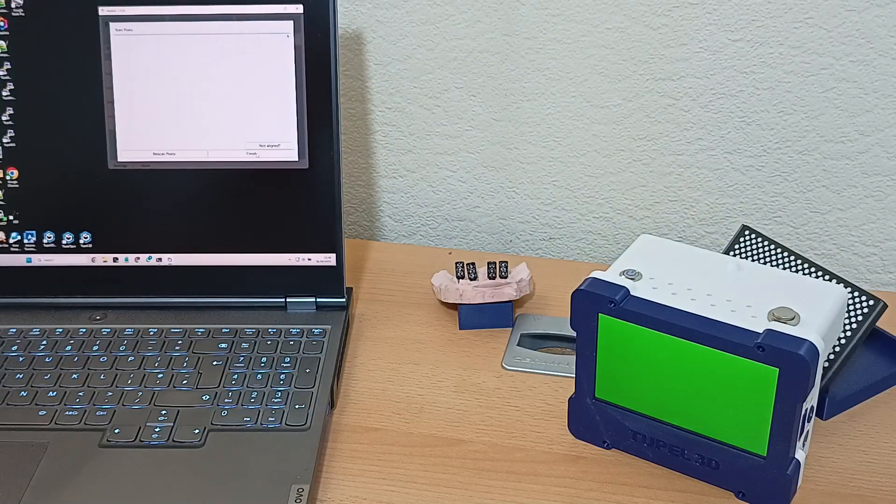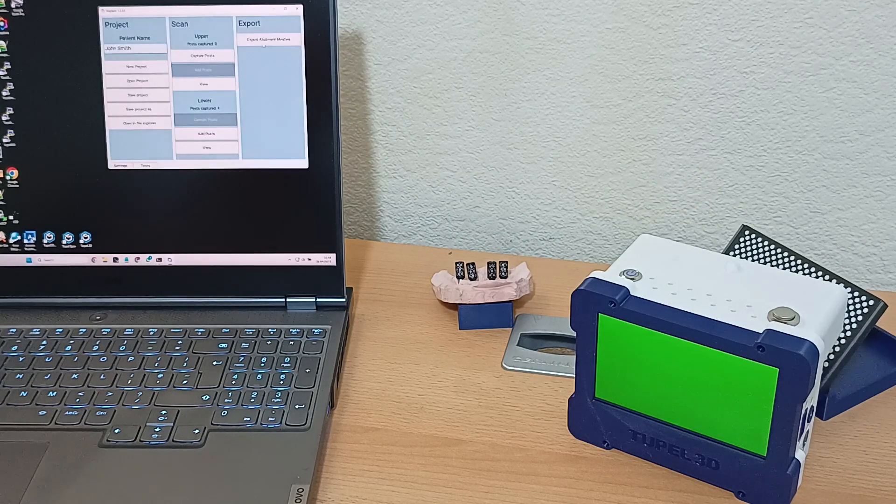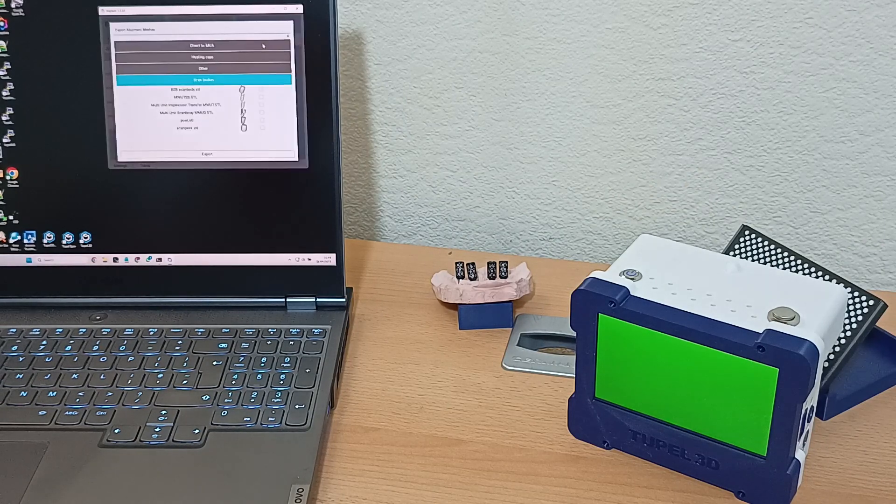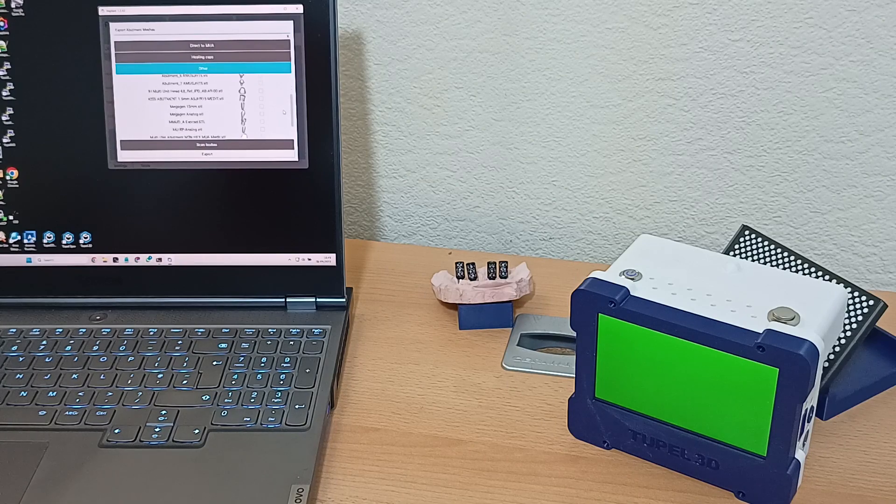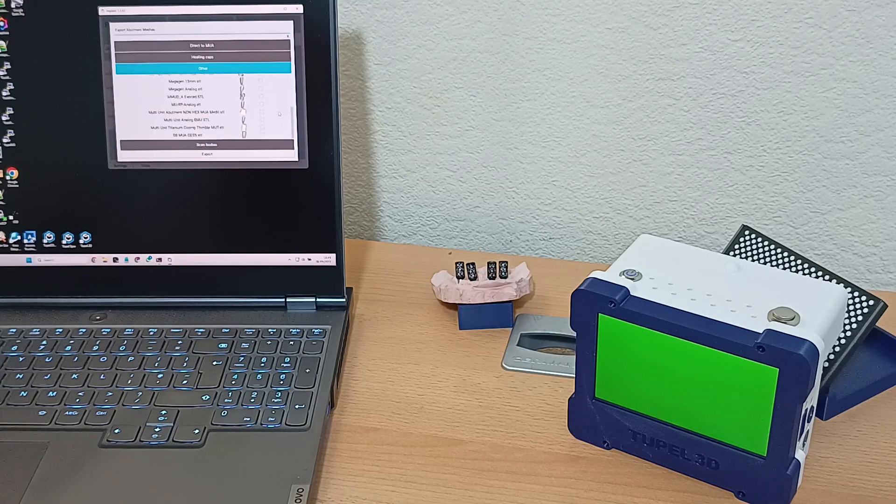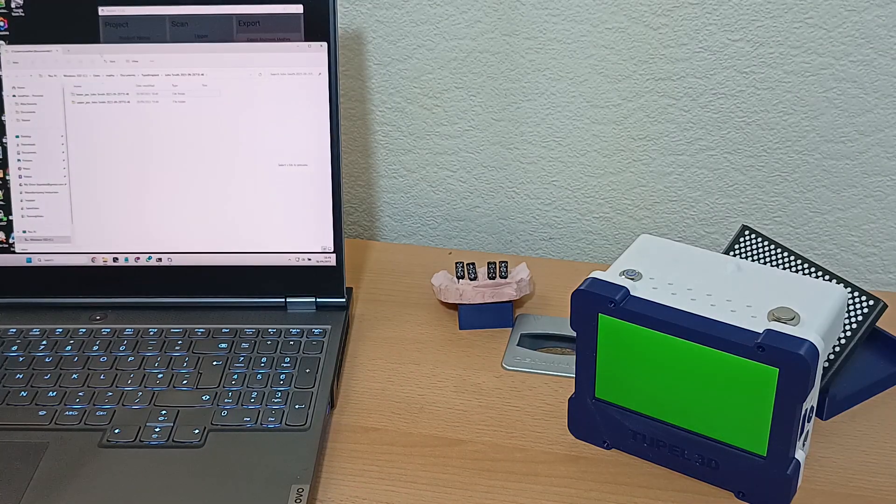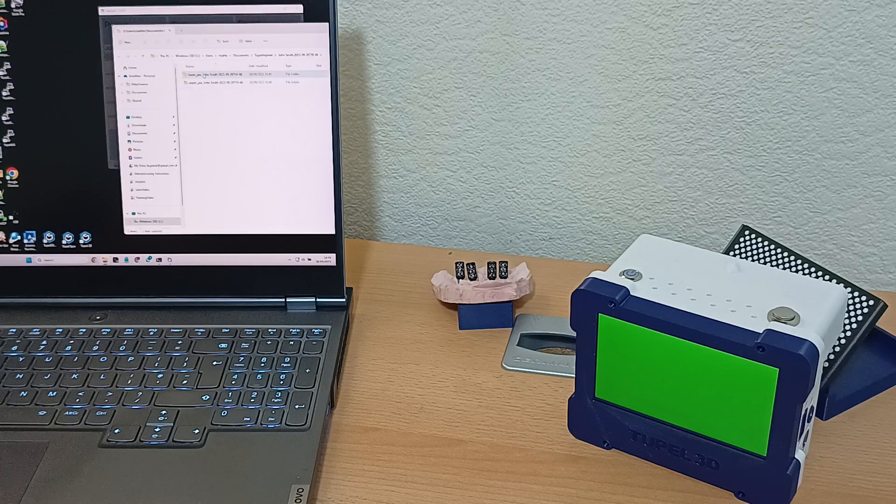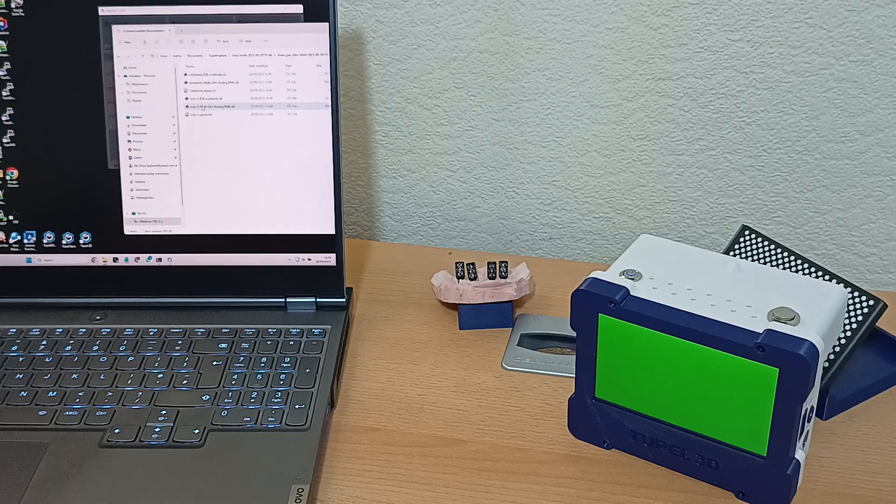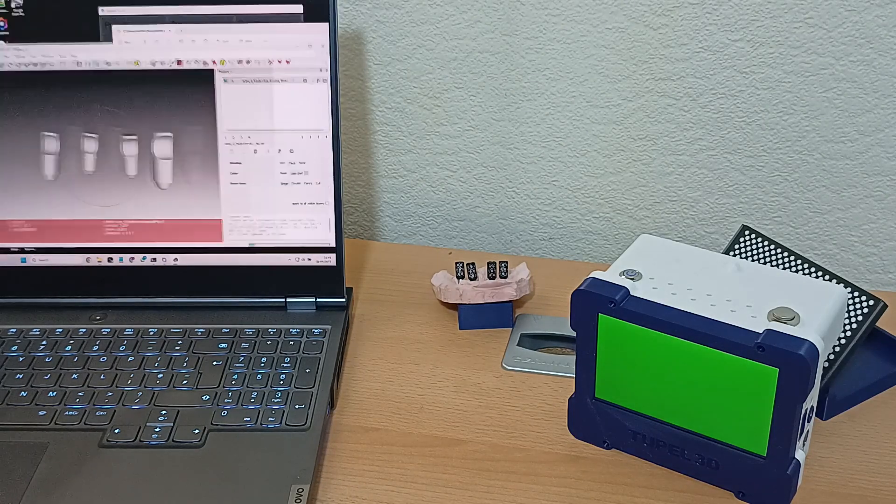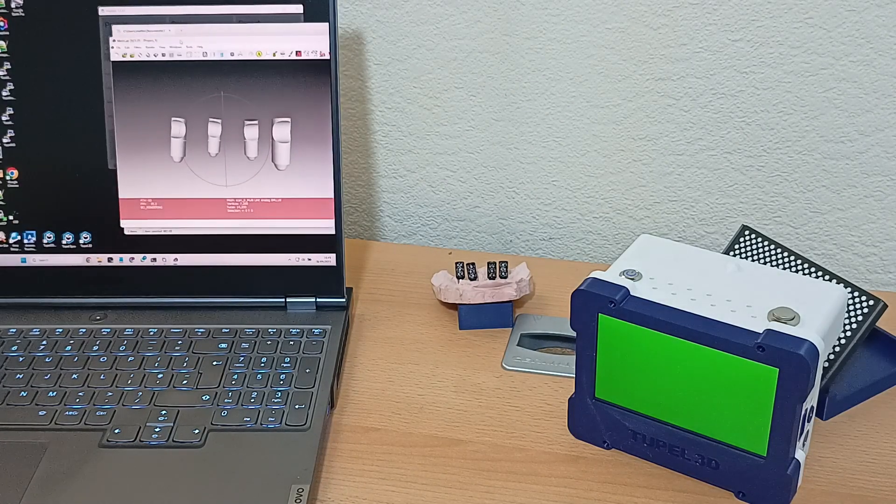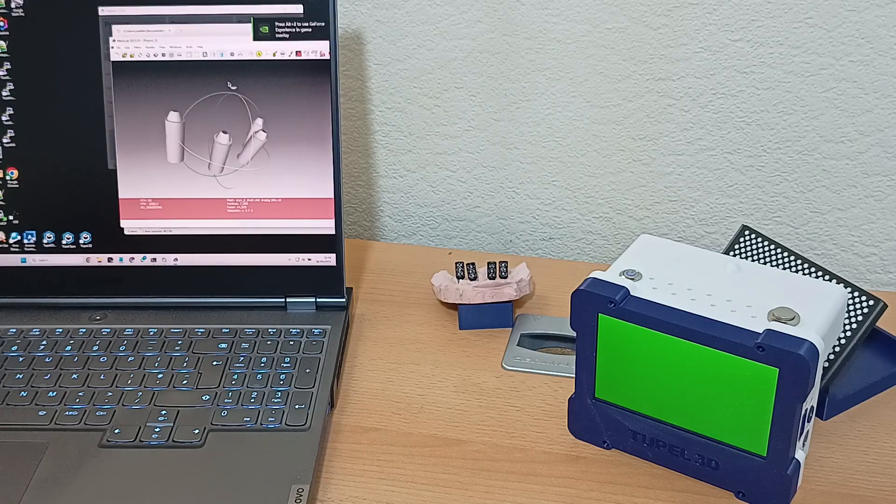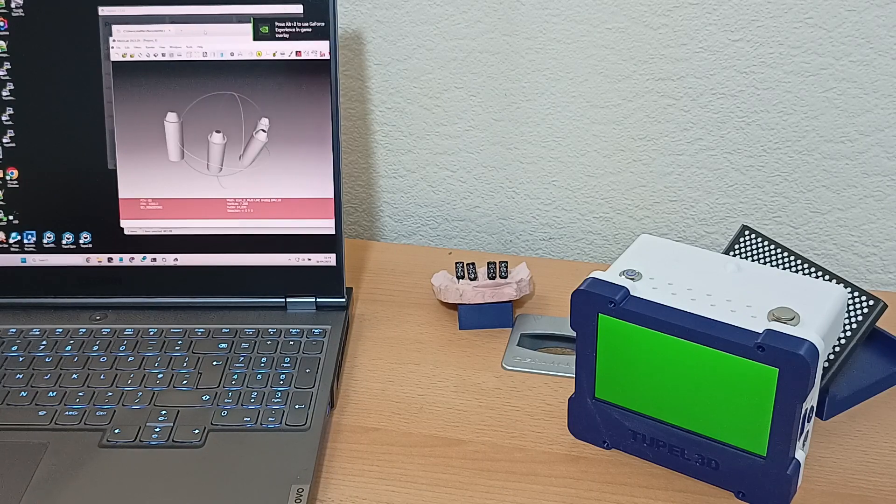And you can see it's captured the posts correctly here. Now we can export highly accurate STL files of the abutment locations. You can see them here, and now you're ready to carry on the design process in whichever software package you choose.